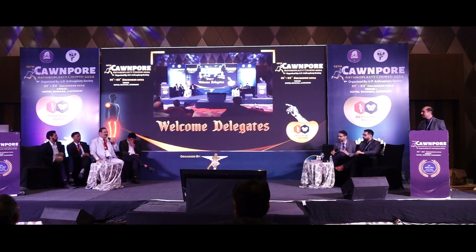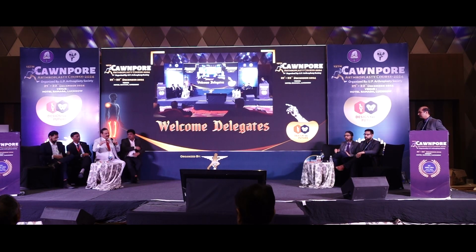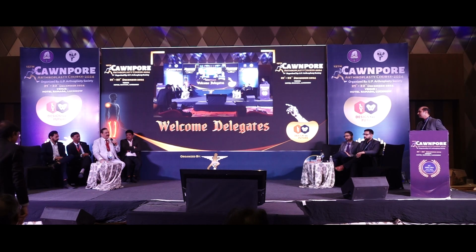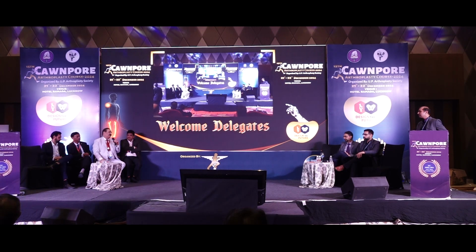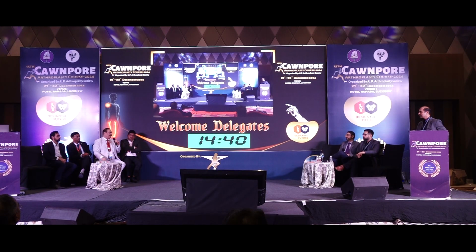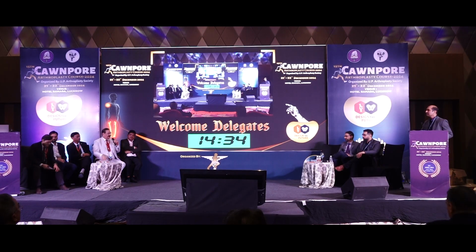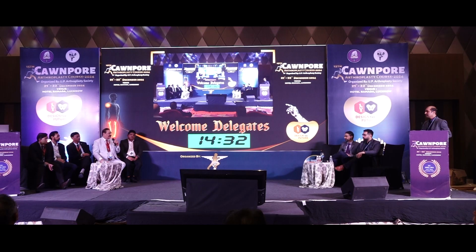If you are not sure of your implant placement, I'm just talking broad categories, usually we don't use it. Very soft bone, you worry about perforation. Revision scenario, have you removed enough cement? Is there something blocking it? These are a few situations where we need an image intensifier, but not routinely.